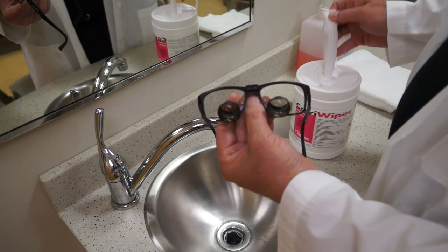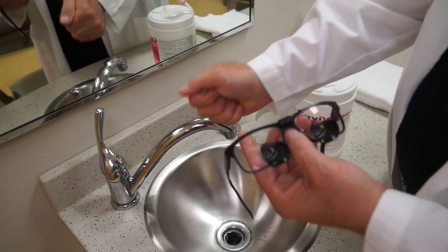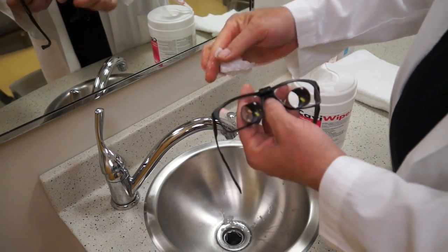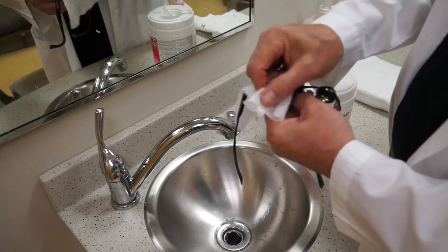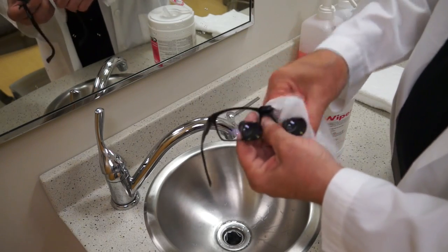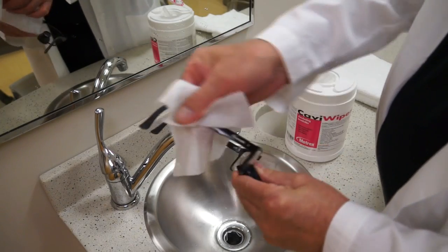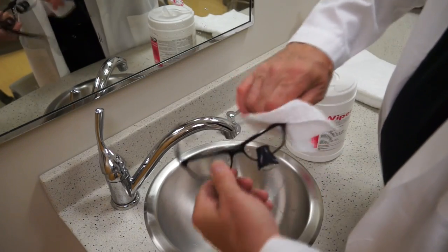Take your Cavicide Wipe, wring out some of the excess liquid, and wipe all the surfaces off — front, back, both temples, across the top.